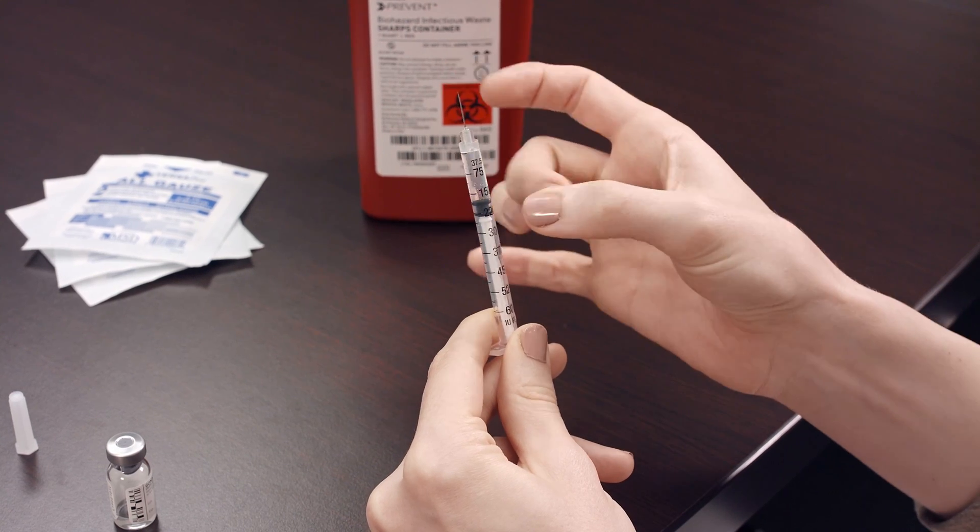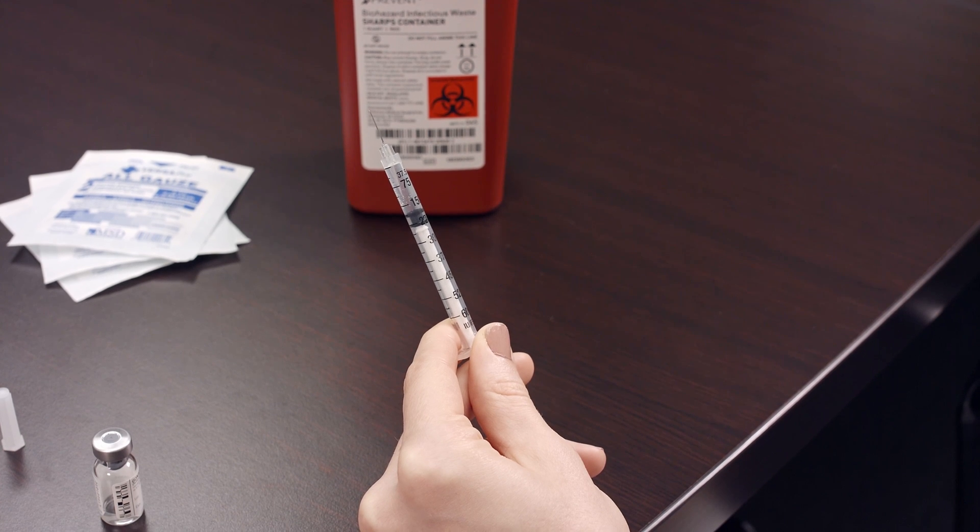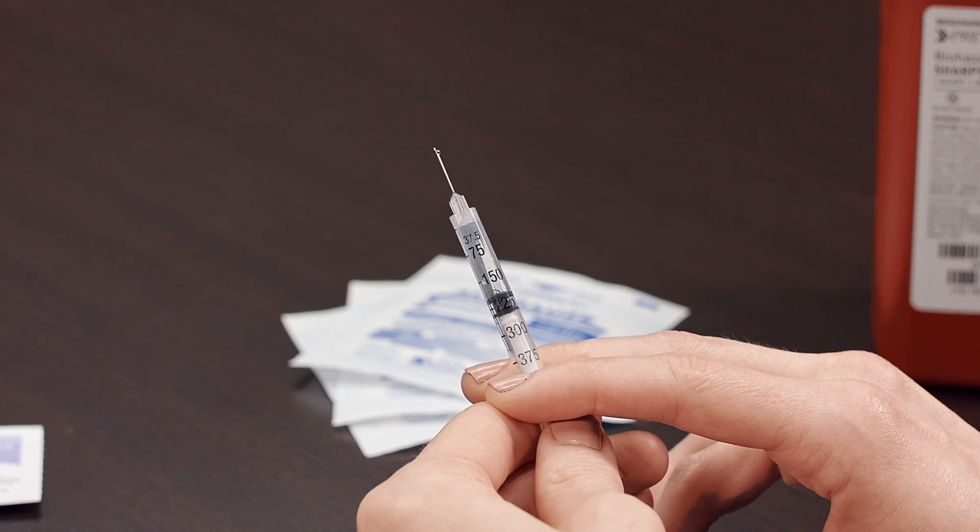Still holding the needle upright, gently tap the side of the syringe until the air bubbles migrate to the top. Apply slight pressure on the plunger until a drop of liquid appears at the tip of the needle.